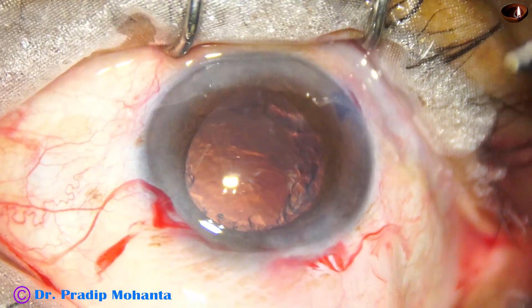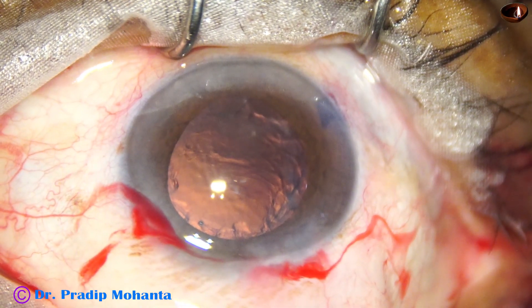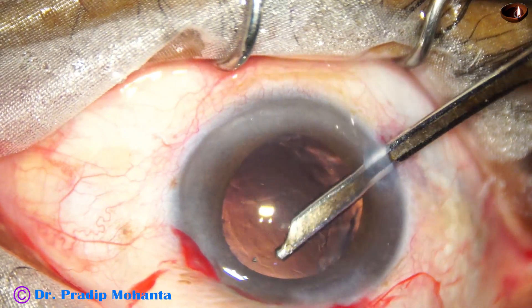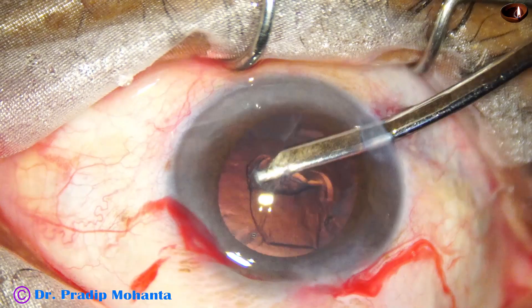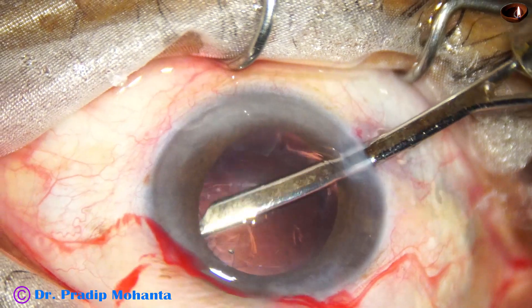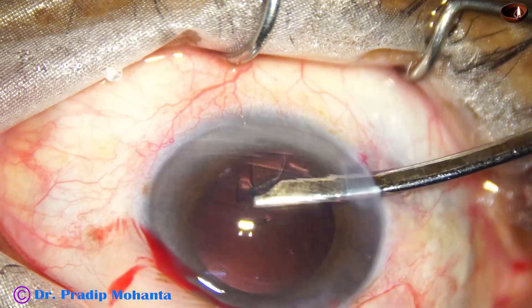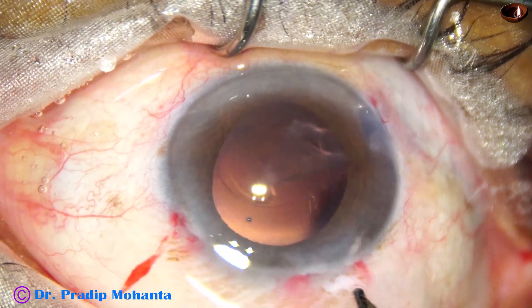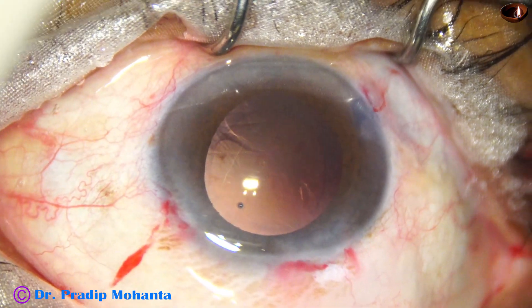Now the cortex is to be removed. There is some chemosis superiorly because the conjunctiva has overlapped the limbus. So I enlarged the side port at eight o'clock and using a 23-gauge Simcoe cannula to remove the cortex. I could remove most of the cortex by this side port — the anterior chamber remains very stable if we go through the side port. Cortical clean-up is done.